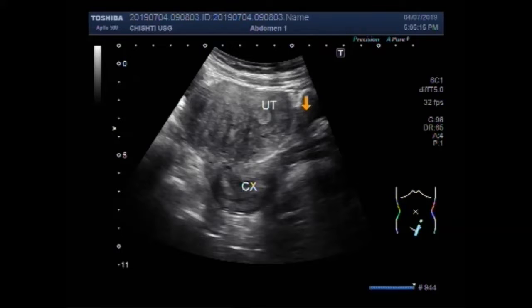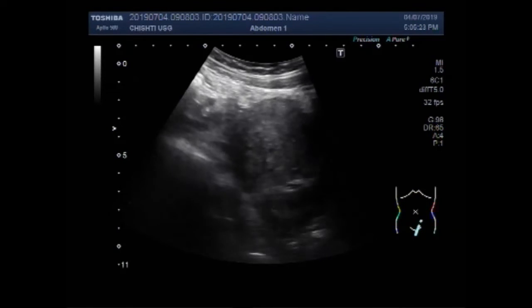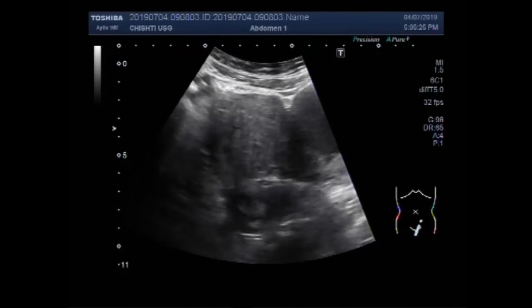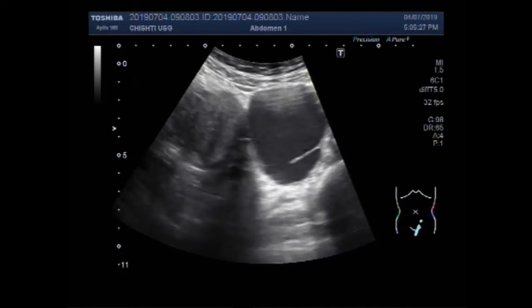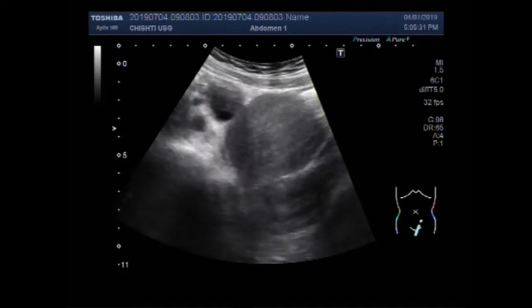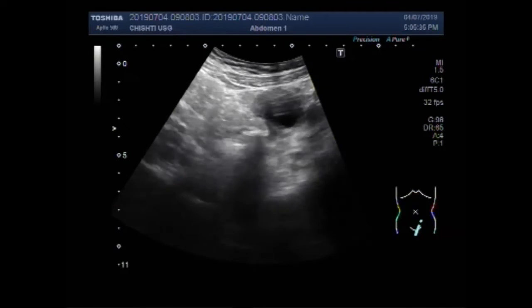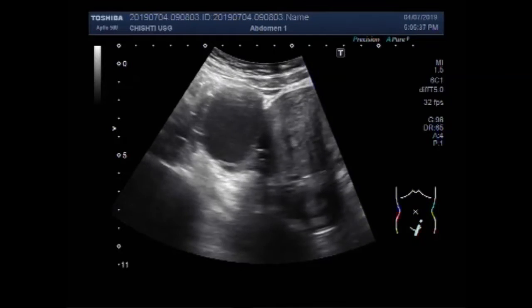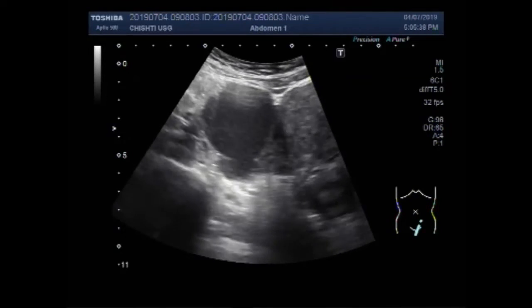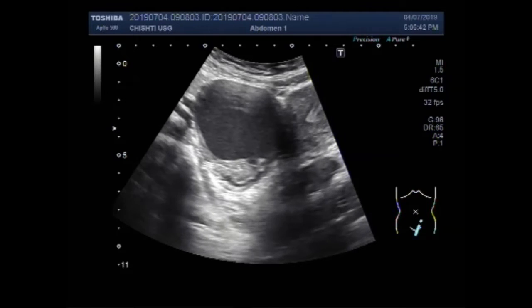This is the uterus, this is the cervix, urinary bladder, and this one is the mass in the middle and distal portion of the uterus near the posterior wall. Now you can see a small simple cyst in the left ovary and a large right ovarian cyst.